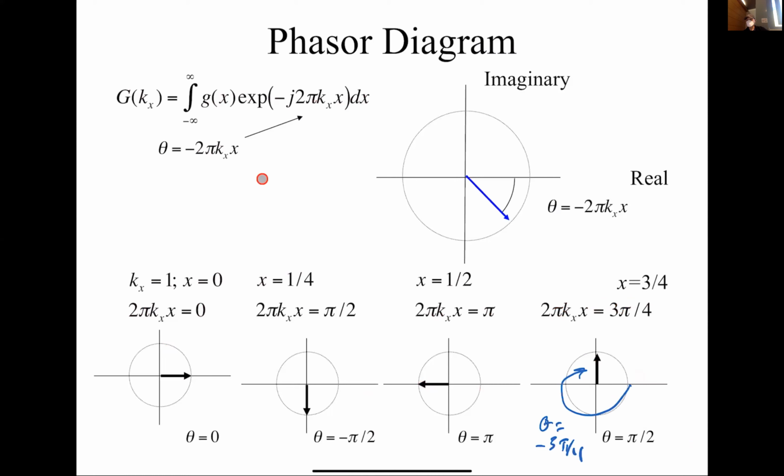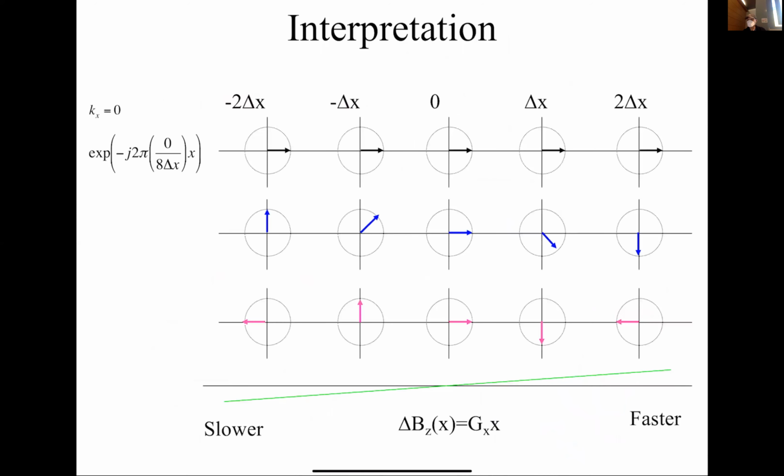So what we're seeing is that this term that we need in our Fourier transforms is just some time spatially varying phasor. And we just saw that if you had spins in the presence of a gradient, you could get a spatially varying phasor. So we were sort of seeing that if we can just impose these phasor patterns on our object, maybe we can get what we need for a Fourier transform. Okay, so let's take a look at that.